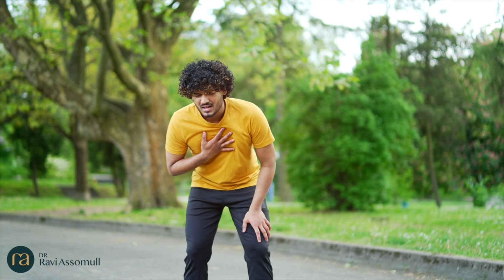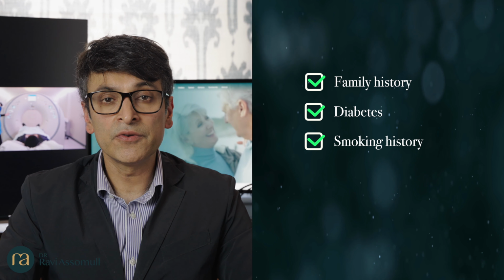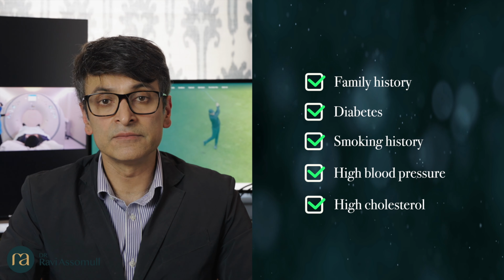A CT coronary angiogram is particularly valuable in individuals who have been experiencing symptoms such as chest pain or breathlessness, and in these particular individuals it is critical to rule out blockages in the heart arteries. However, more recently these scans are being used in individuals without any symptoms but in whom we suspect that there is an increased risk of cardiovascular disease. This includes individuals who have a family history of heart disease, who have diabetes, who smoke, who have other cardiovascular risk factors such as high blood pressure and high cholesterol.